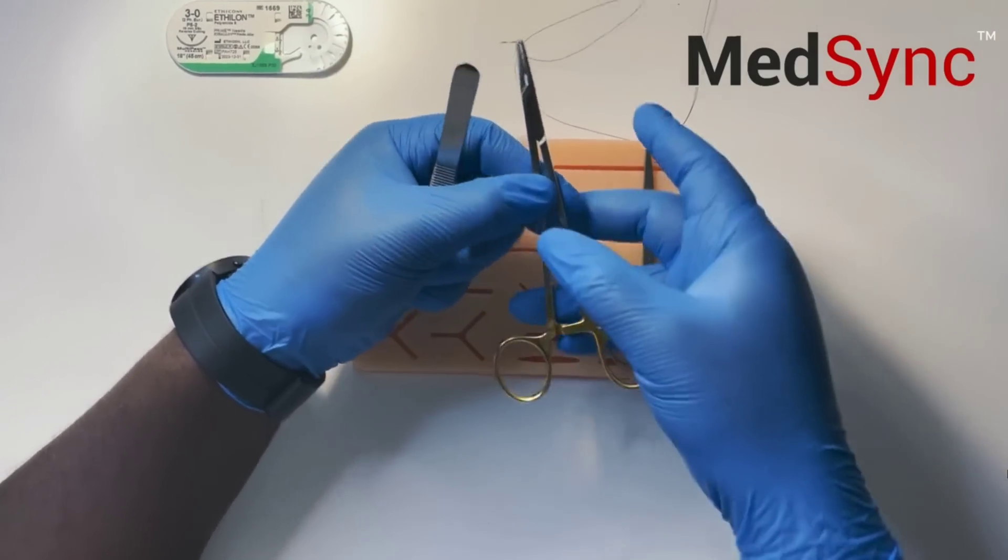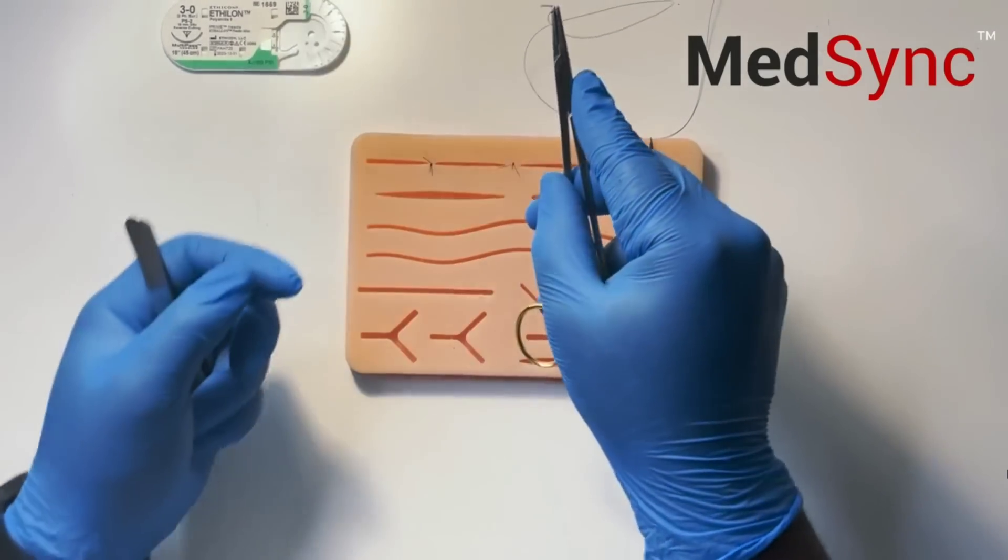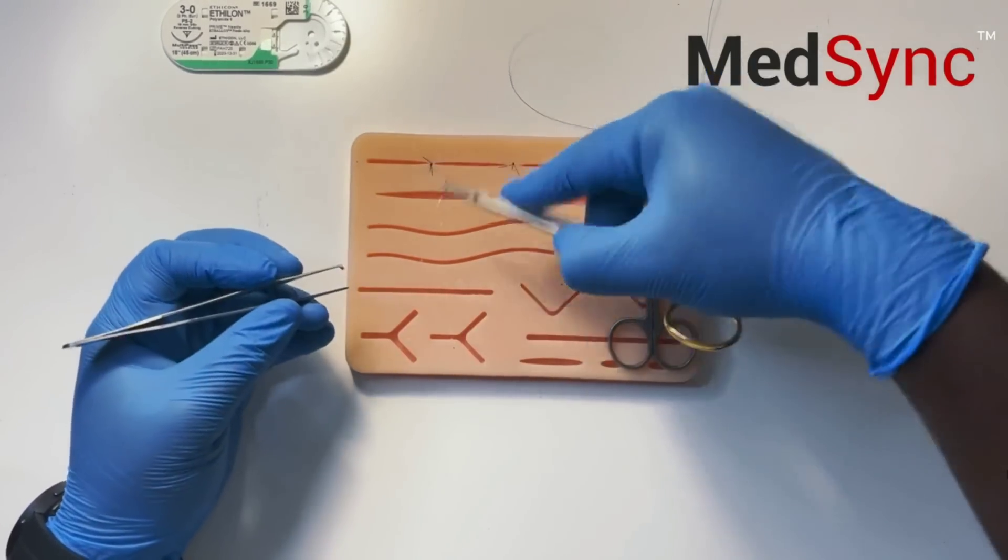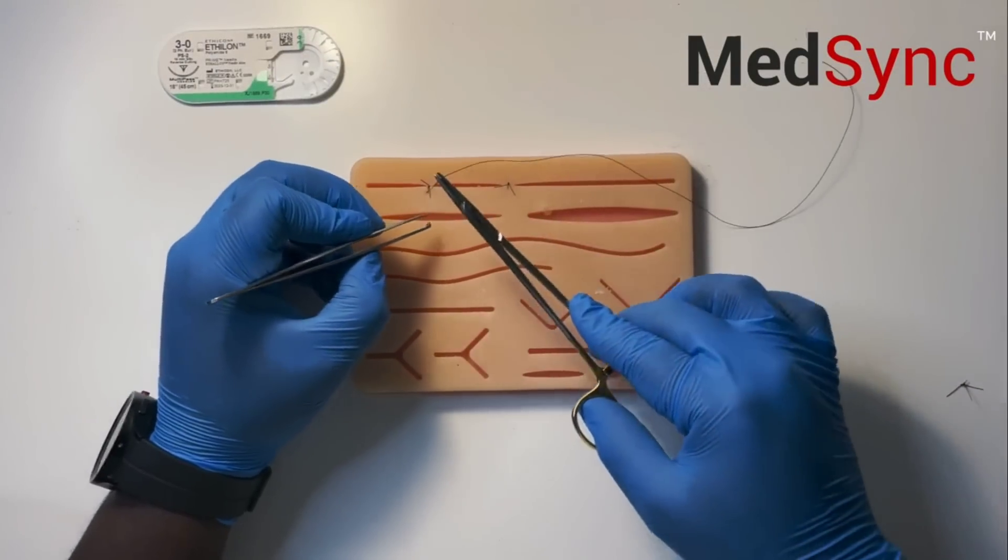The second way is to palm your needle holder. This allows you to suture at depth. Let me show you when this is useful.